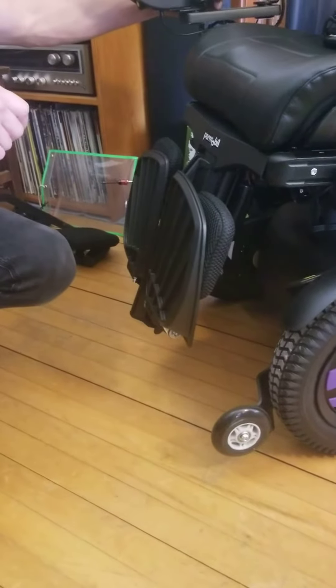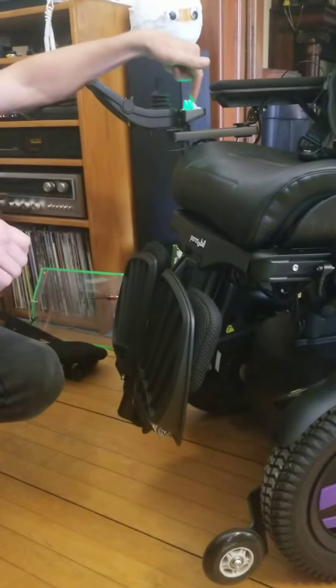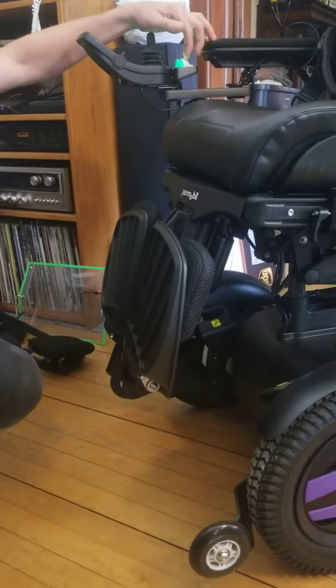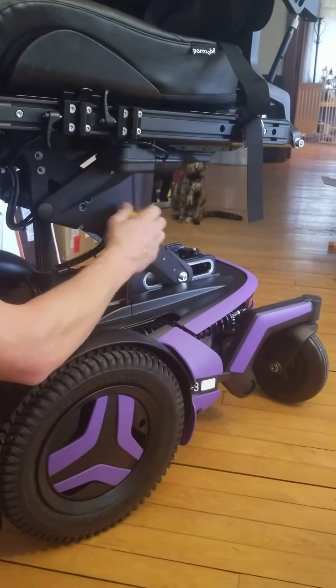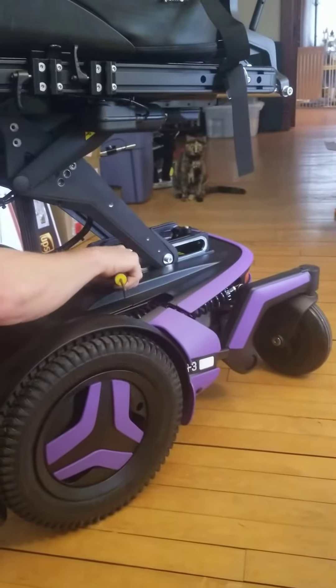First, elevate all the way up so you can get room in here. You've got a battery here and a battery here. There's a little hand knob here, and also use a four millimeter Allen wrench.